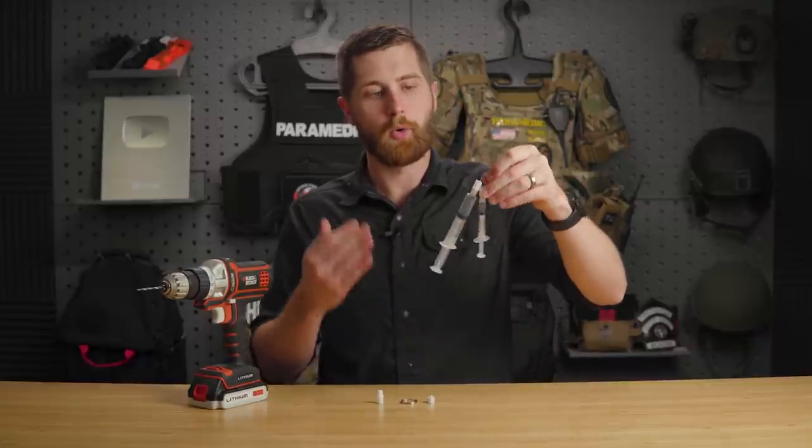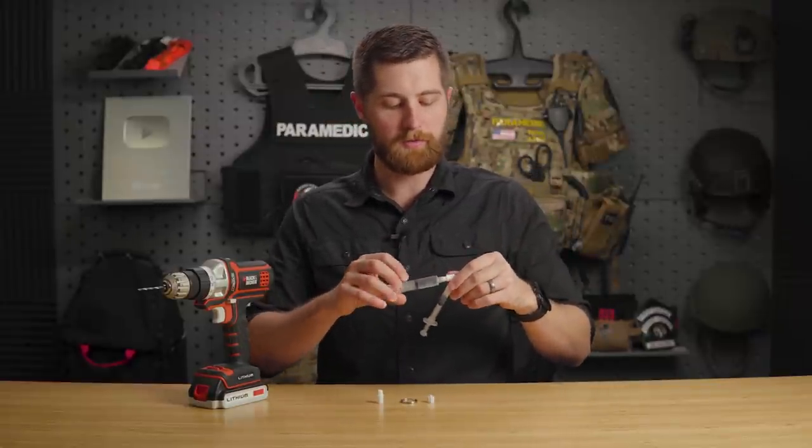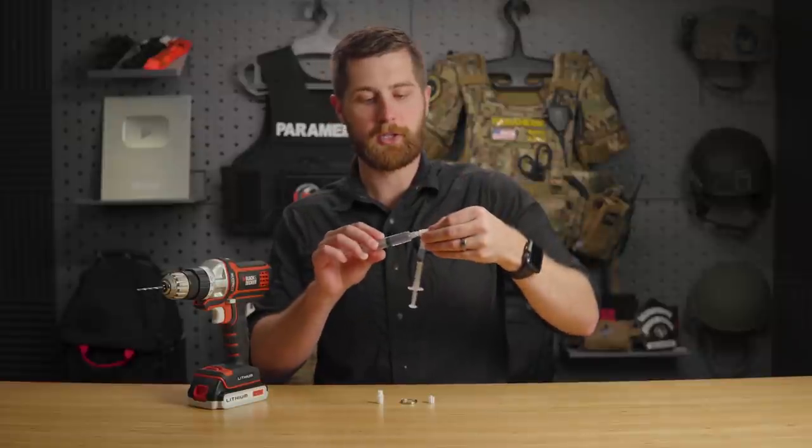This device here is an old trick that I was taught by an old critical care nurse, and what it involves is caps that you can take.